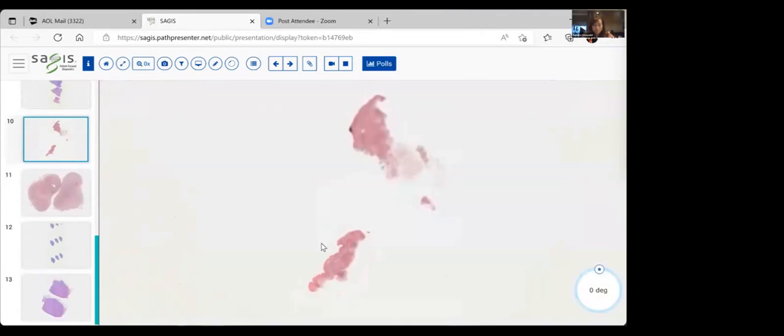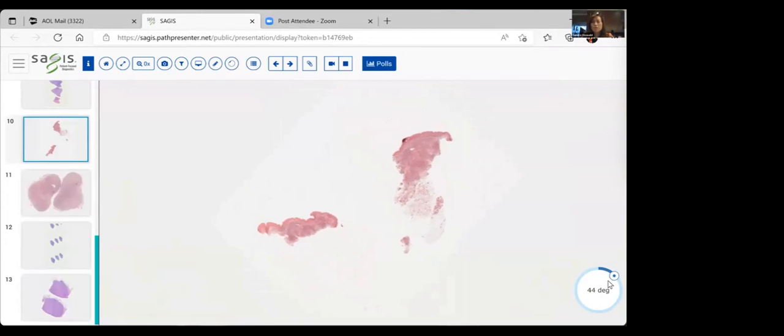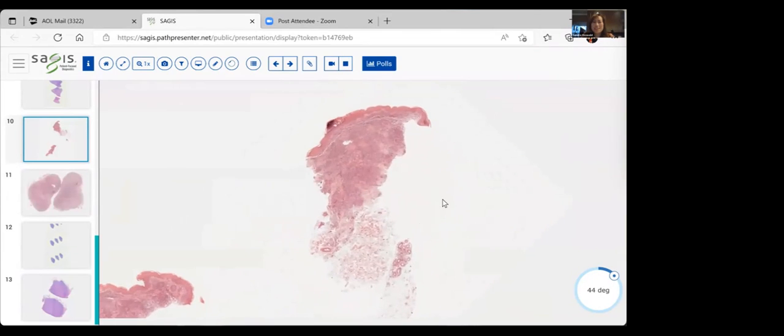We're going to number 10. 10 is a treat. I have to say it's a treat because I've never seen this clinically, but I've seen the pathology just a few times. So I was very thankful because I wanted to show you this one, that they found a case of this.